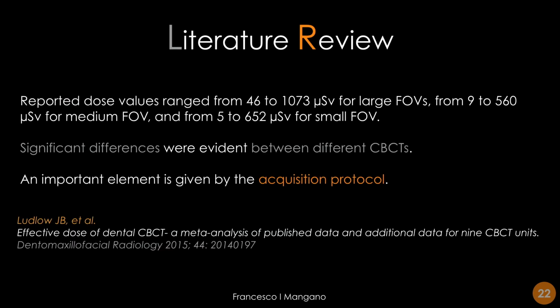And this systematic review more or less confirmed the evidence emerging from the previous studies. And Ludlow, with another literature review, found that there are also significant differences between the different cone-beam computed tomographies that are available in the market. In this case, the author considered that the acquisition protocol is absolutely very important. And I think it's one of the most important things we should consider now, because now, after 20 years, cone-beam computed tomography is spreading all over the world.